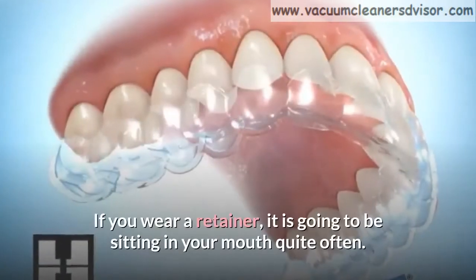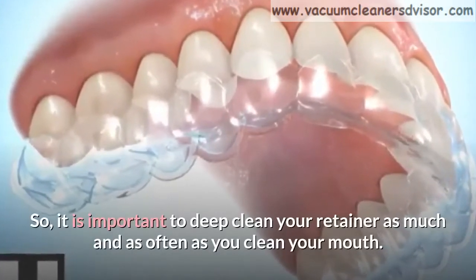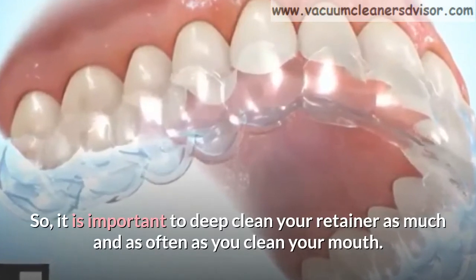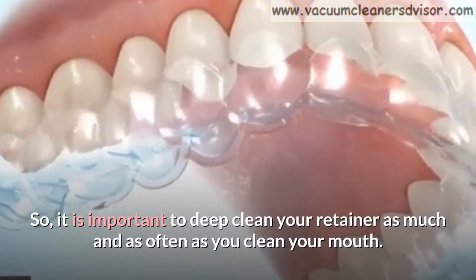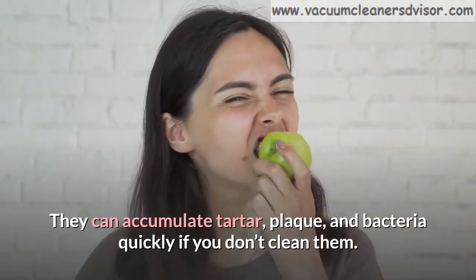If you wear a retainer, it is going to be sitting in your mouth quite often. So, it is important to deep clean your retainer as much and as often as you clean your mouth. They can accumulate tartar, plaque, and bacteria quickly if you don't clean them.